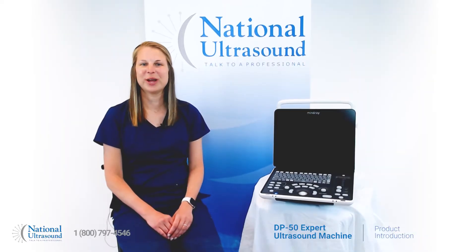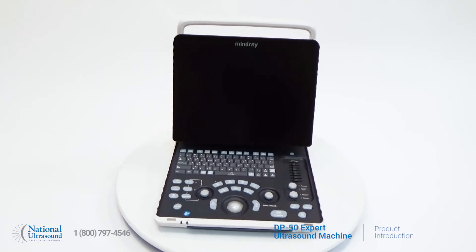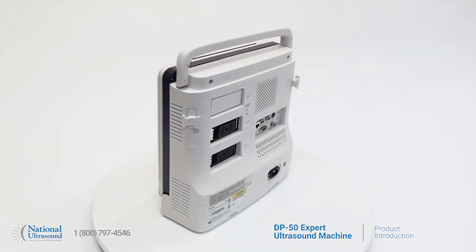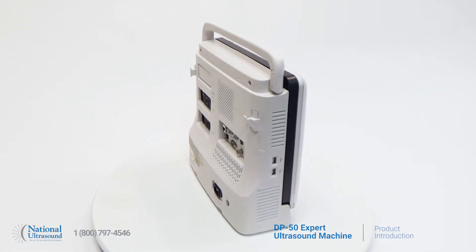My name is Jackie and I'm a registered general vascular and cardiac sonographer with eight years of experience. Let's take a look at the new Mindray DP50 expert ultrasound machine. The DP50 expert is a versatile portable black and white system with optional color Doppler and pulse wave features available as add-ons.